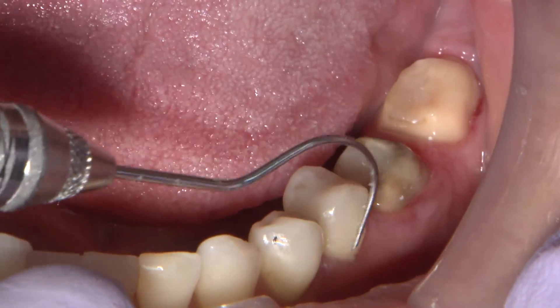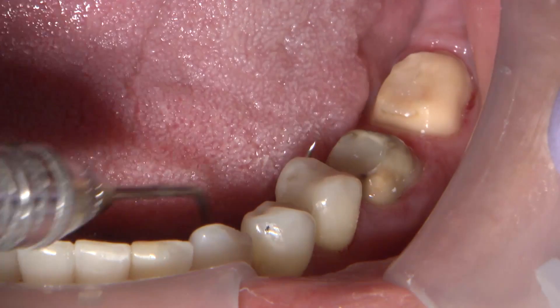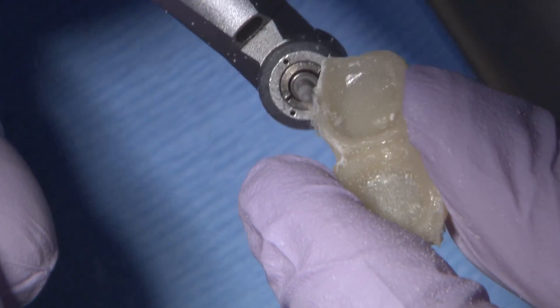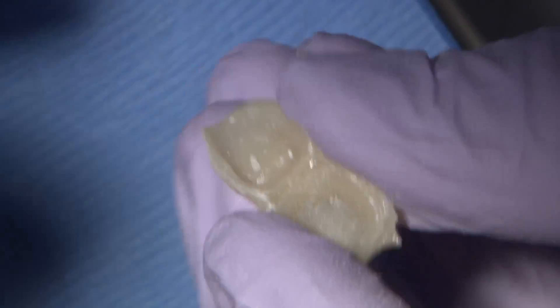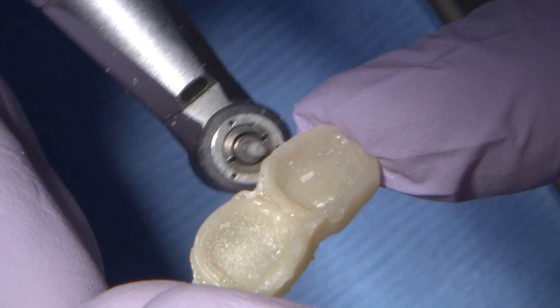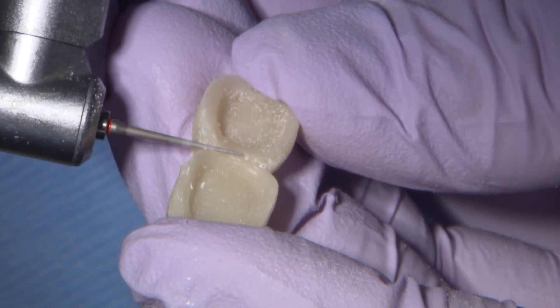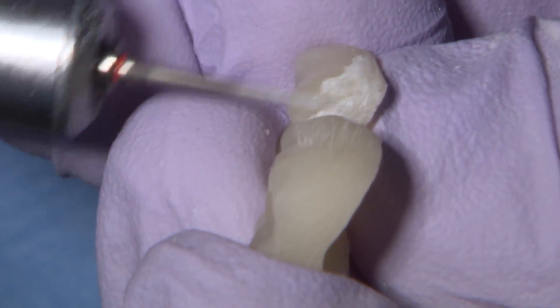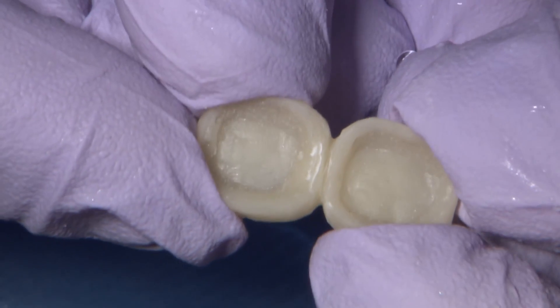Very importantly, right after bringing the relined BioTemps out before trimming, I make sure there isn't any excess reline material or acrylic on the teeth. If you don't do it right then, the patient is going to feel high spots that aren't your BioTemps but simply excess material within the mouth. I trim chairside right beside the patient, keeping a good fulcrum at all times to keep the drill nice and steady. I smooth everything out and then use a long thin diamond flame burr to open the embrasures so the tissue can breathe, the patient can floss underneath with a floss threader, and no food gets caught in there.